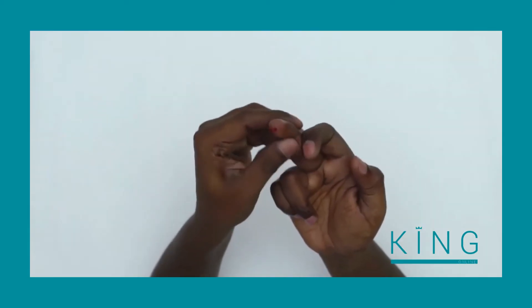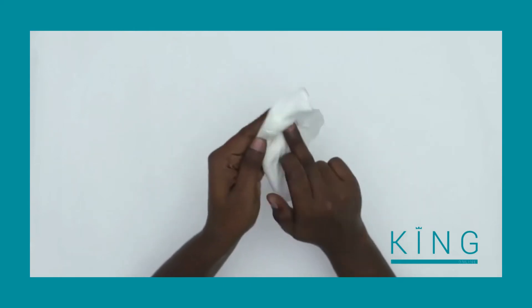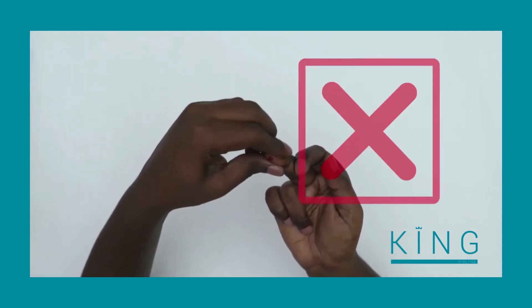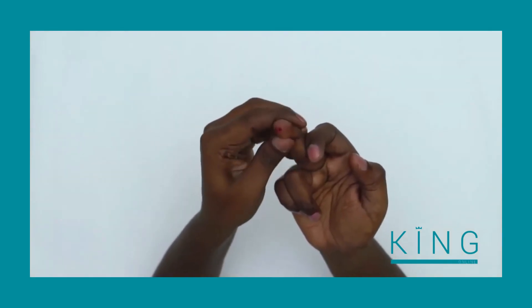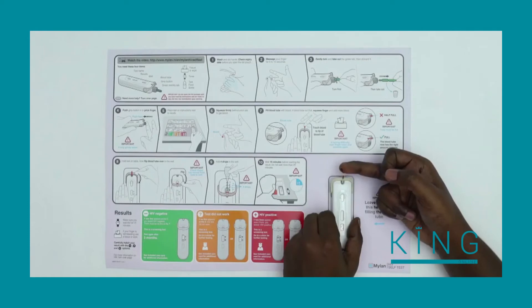If the tube is not full, squeeze your finger again behind the prick site. If you're having trouble filling the tube or blood has smeared on your finger, take a moment and wipe your finger clean. Do not pinch your finger in front or to the side of the prick site, as this will reduce blood flow. Instead, firmly squeeze your finger behind the prick site to get more blood and touch the blood to the tip of the tube.